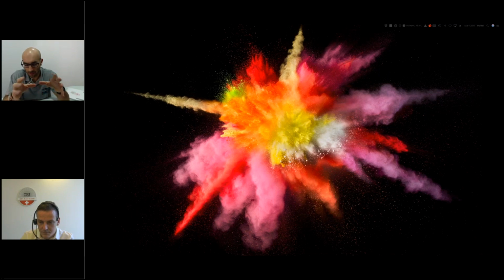This kind of result comes from the impression. So it depends how the doctor takes the impression, and whether the doctor has good experience or not, because we have seen that there are many digital impression systems on the market, many intraoral scanners from a lot of companies. What I can say is that almost all of them work, but they need a dentist with good experience to work in a proper way. So the difference always comes from the human side, not from the machine side.